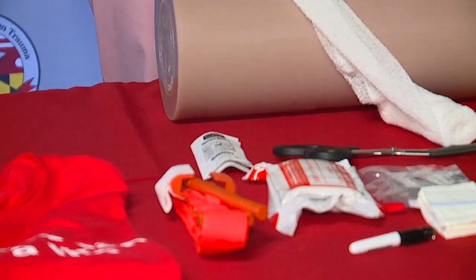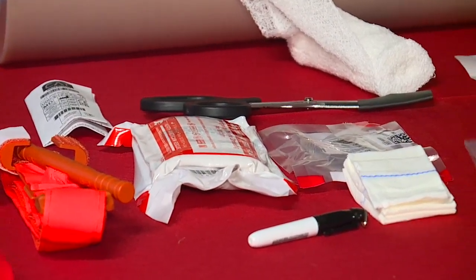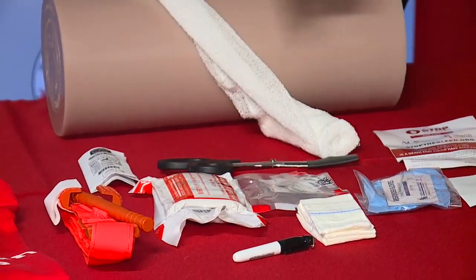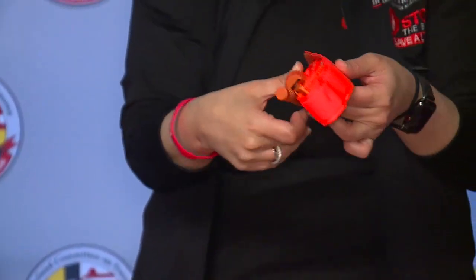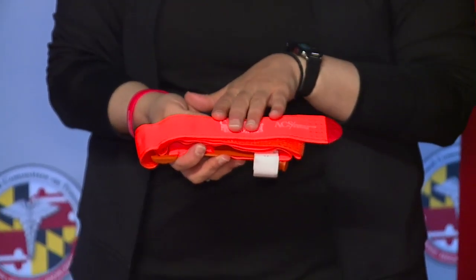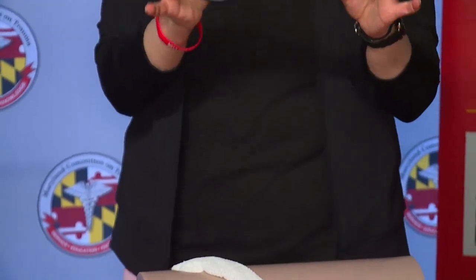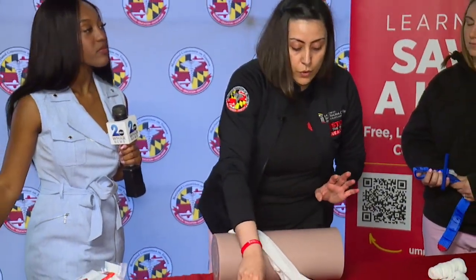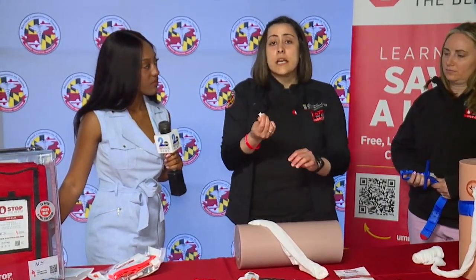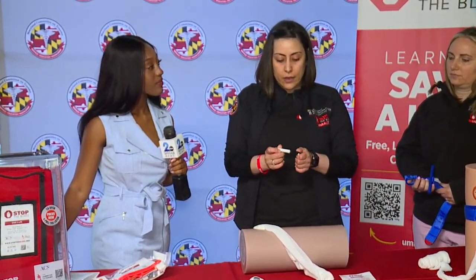So one of the most important things when you are helping someone who is injured is your own safety. So you have to make sure that the area is clear. You also want to wear gloves, so the kit has gloves in it. And then there are two types of medical gauze that can be used to actually pack the wound. In addition, you get your own tourniquet, which is the American College of Surgeons approved tourniquet for stopping the bleed. You also get what we call trauma shears so that you can cut any extra of the gauze that you're packing in. And most importantly, you get a marker so that you can mark the time if you place a tourniquet on someone so that once they arrive to the hospital, they're aware of how long the tourniquet has been up.